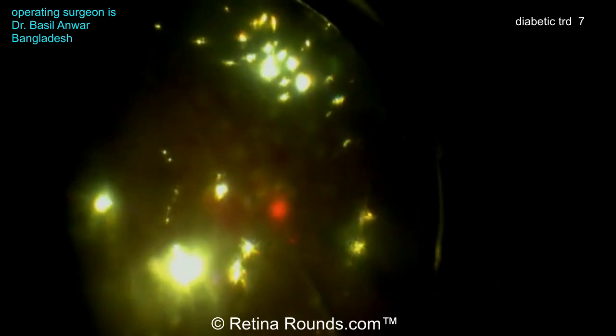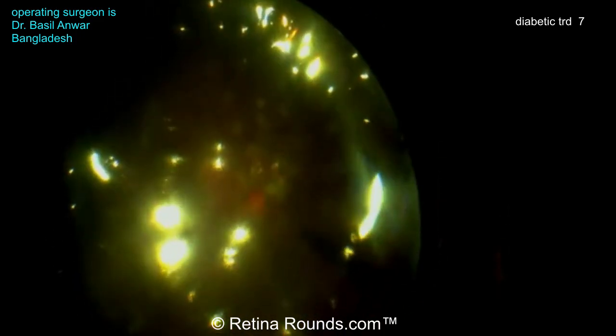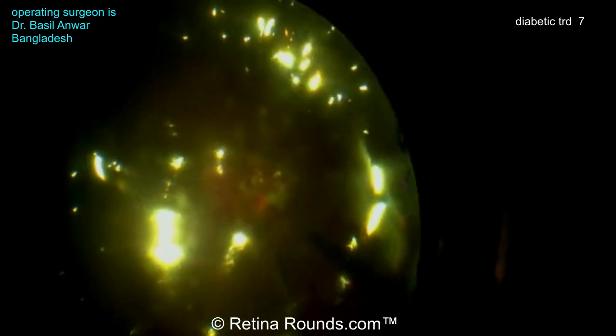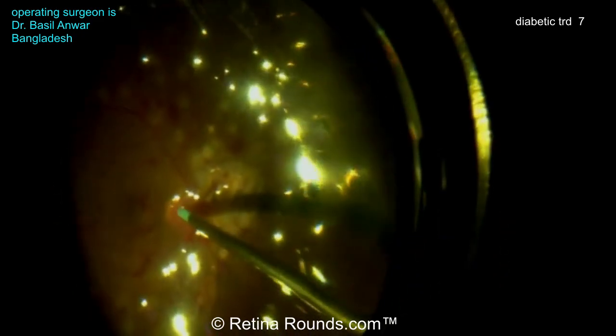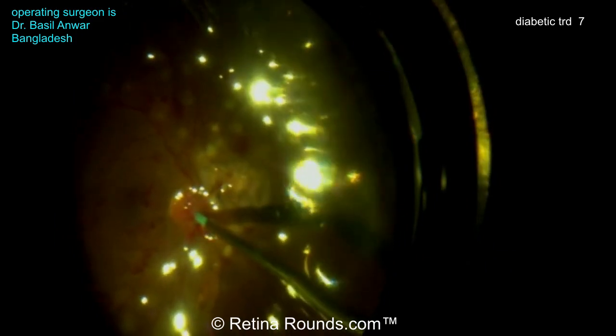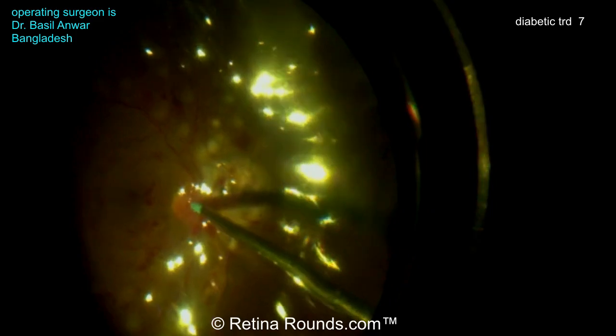Now he's going to be able to apply laser around that break. The laser retinopexy is going to be more of a confluent three-row burn around the retinal break, as opposed to the PRP, where the spacing is going to be anywhere from half a burn width to a burn width of spacing. You can see the confluent laser now nasal to the optic nerve. One last air-fluid exchange and that should complete the case.